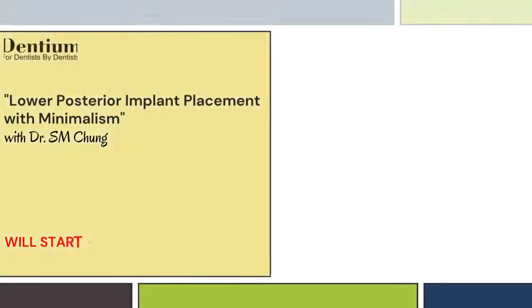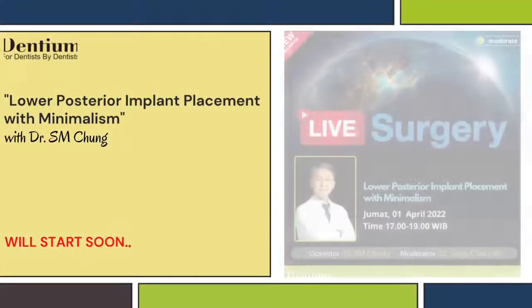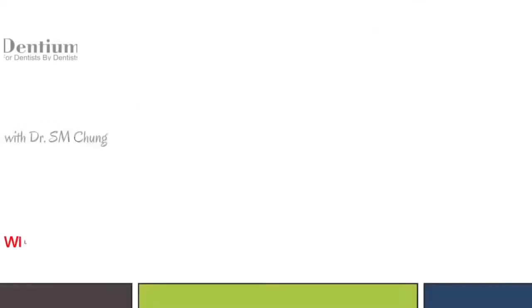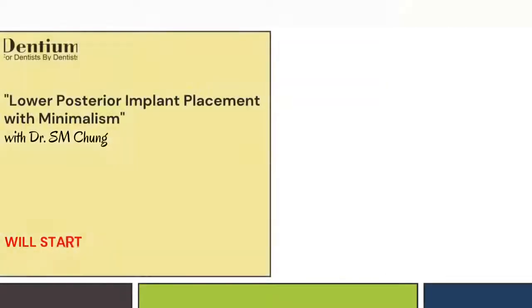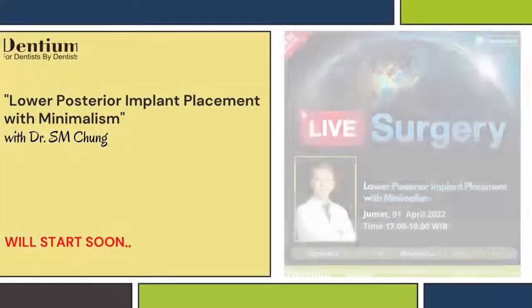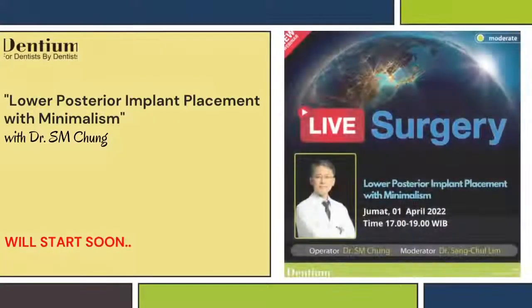This scan comfort cap has a dual function. The first is working as a healing abutment. The other is working as an intraoral scanning jig, right? So we can make the temporization, the temporary prosthesis, immediately, and the final restoration also in a very comfortable situation.